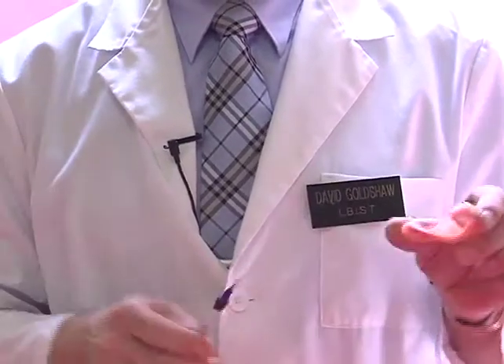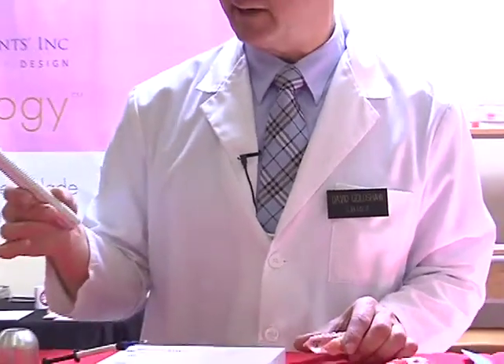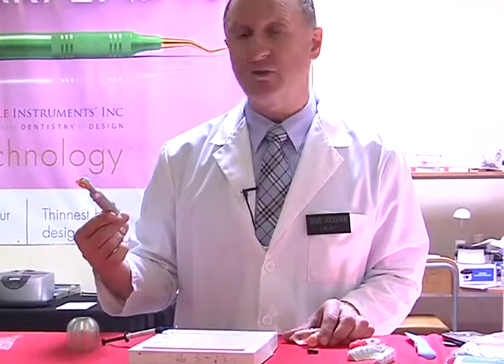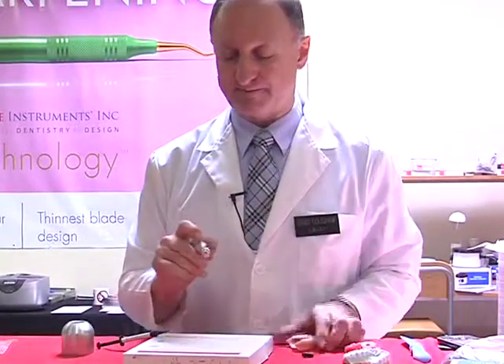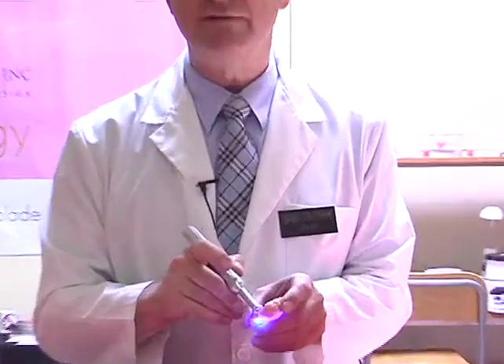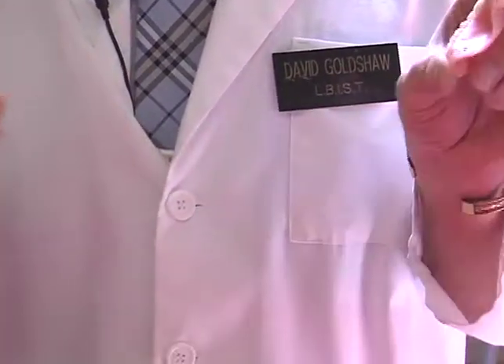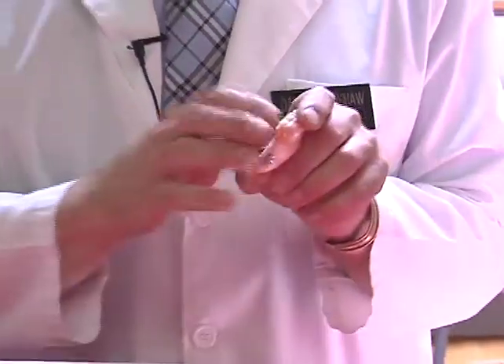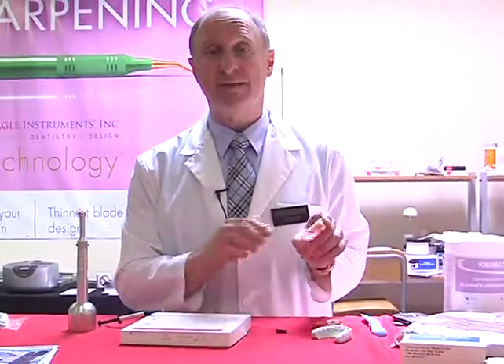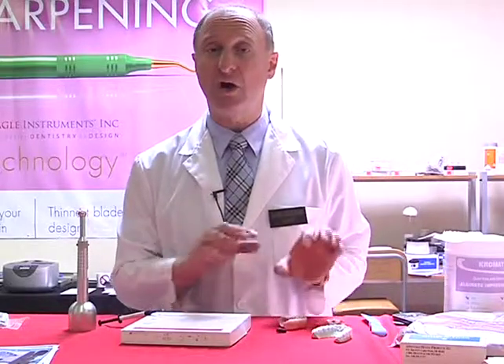Once that's done, we take hold of our light curing pen. Here I have a little curing light that comes from the company called Spring Health. It's a cordless light. I place this down over it and cure normally for 20 seconds. Once it's cured into place, for the next 5 years we have permanently marked the information onto that appliance, whether it be the denture, the mouthguard, or the bleaching tray. So that's a simple way of how we can establish information onto the appliance.